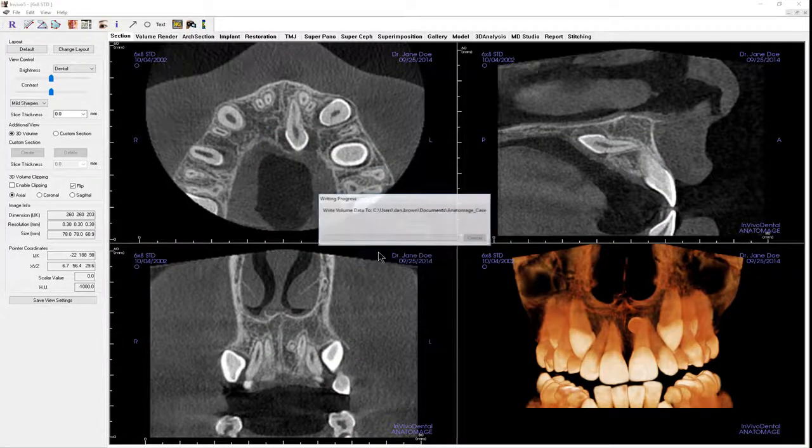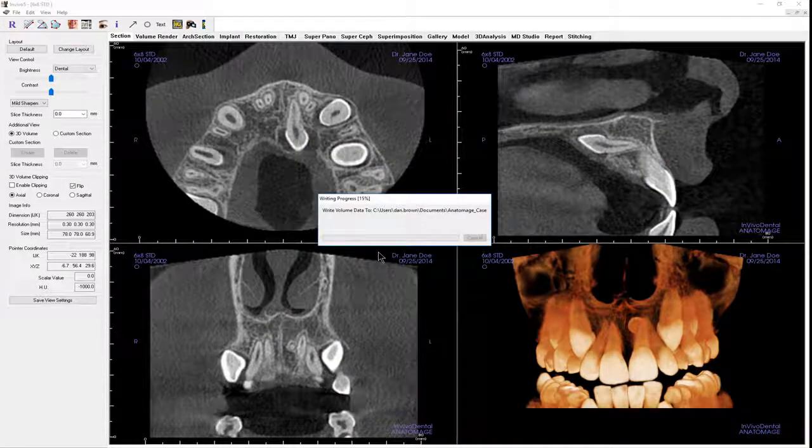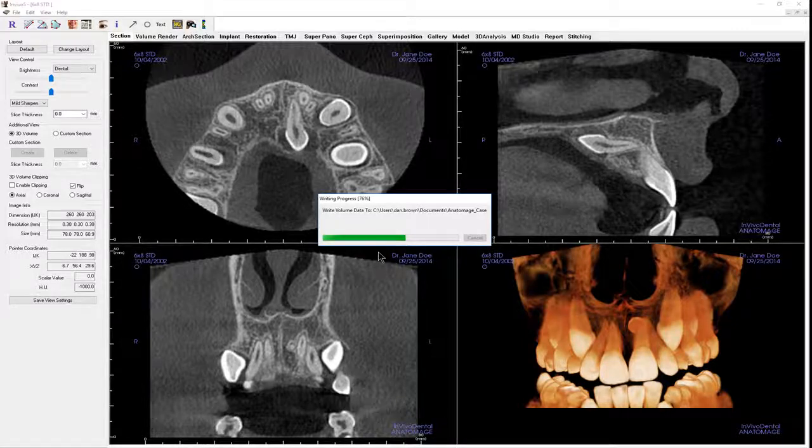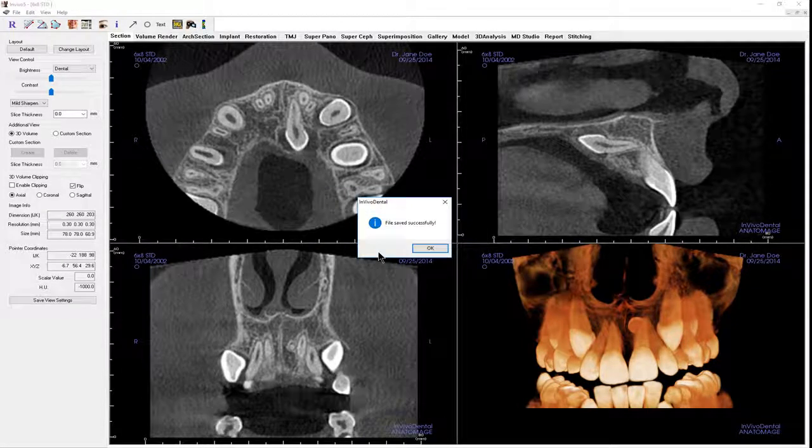If you would like to compress the scan for easier transfer, consult the in vivo reference manual for details.